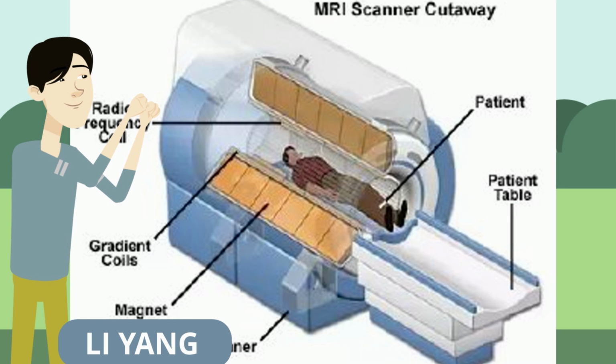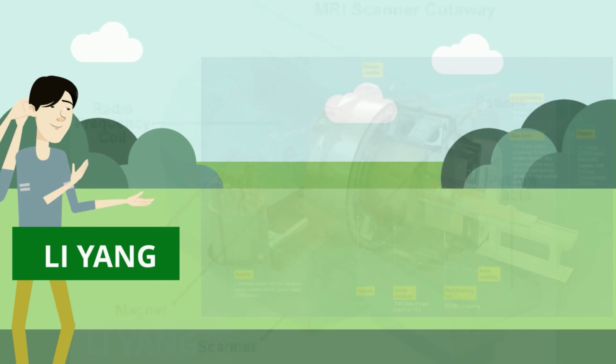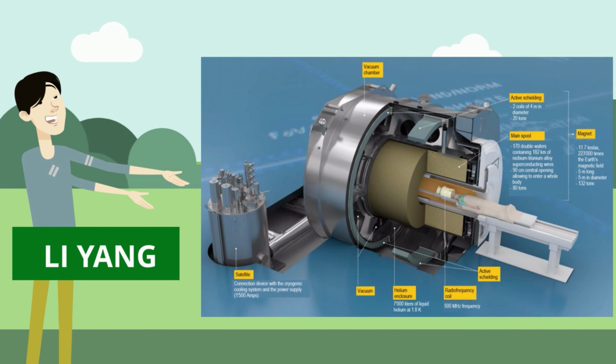To do this, the wires are continuously bathed in liquid helium at 4 to 4.15 Kelvin. As we can see in this photo, the coil is insulated by a vacuum. This is to make sure the heat at room temperature does not affect the liquid helium and waste it. This is very important in making sure the device can operate economically, as liquid helium is very expensive.